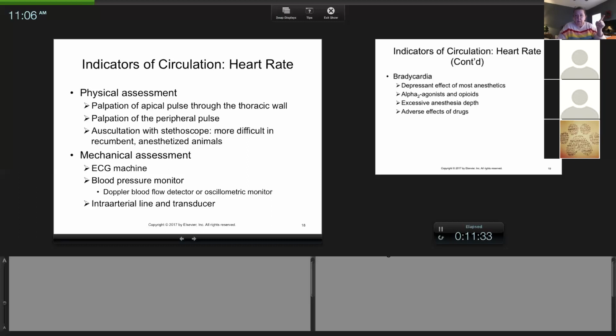I'm like, the only way you're going to tell if that's accurate is listen. Now, if your heart rate's all over the place and it matches, we've got a problem. But nine times out of 10, there's just interference, and what you hear will confirm that that's not accurate. But that's the fastest way.